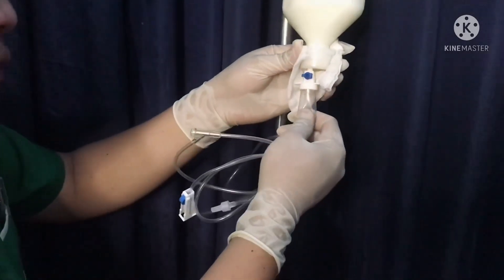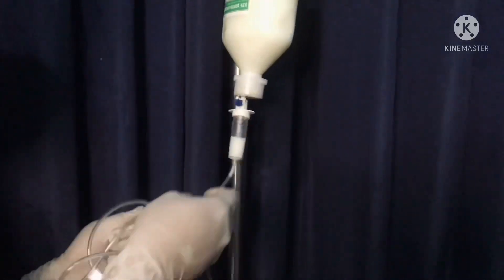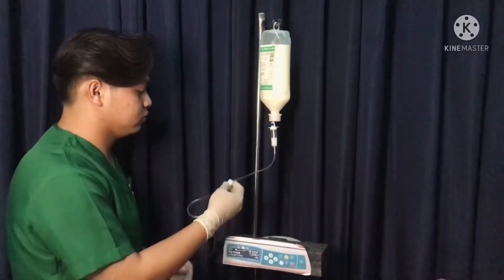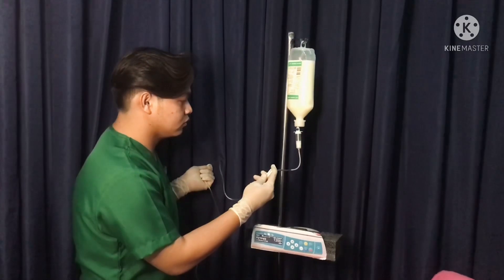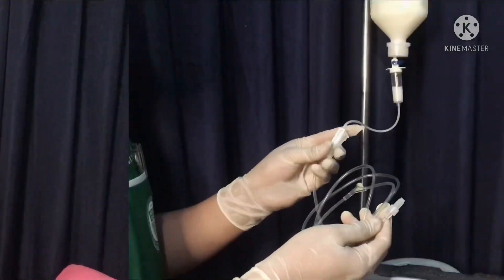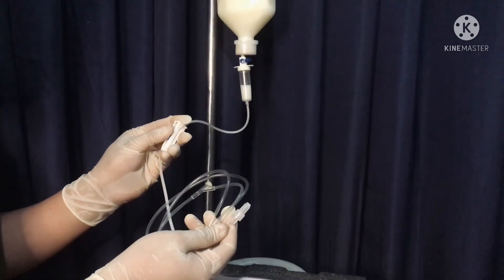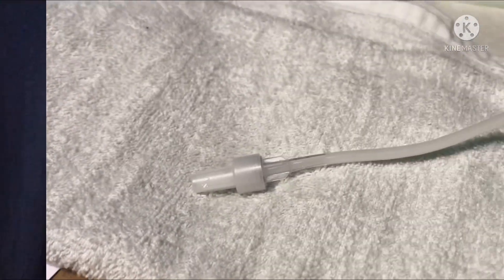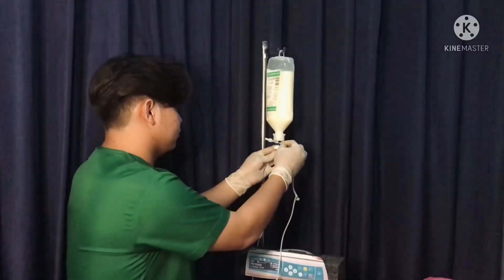Fill the drip chamber halfway. Turn on the roller clamp and prime the tubing set. Ensure that all the air is removed from the line. Then turn off the roller clamp and clip the line to the set.